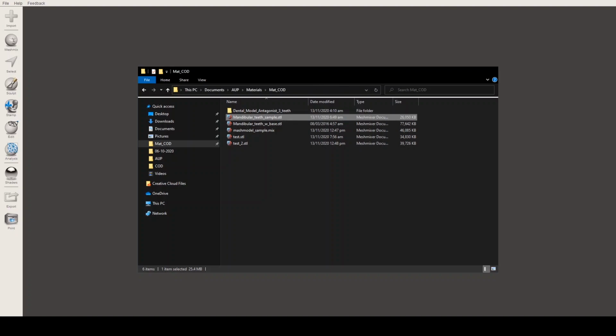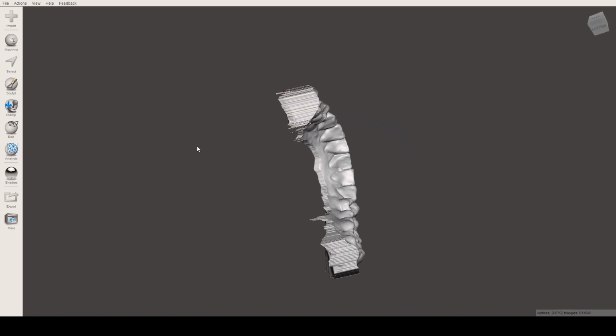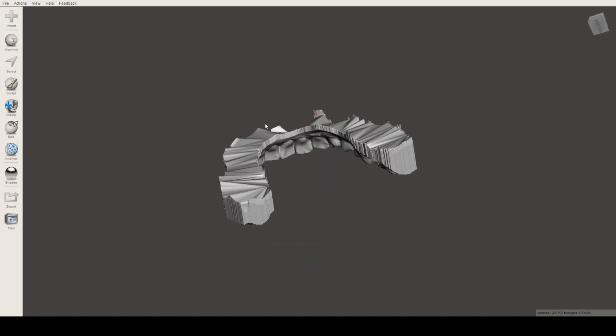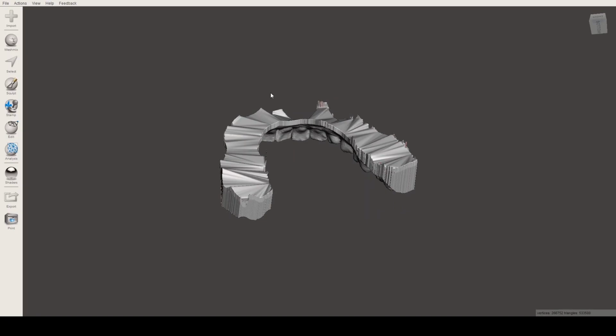So how you can open it is you can drag this into Autodesk Meshmixer. So if you drag it, let's wait for it to open. By the way, Autodesk Meshmixer is kind of slow. It's not really slow, but it's slow if your computer doesn't have enough power to feed it. So my computer right now is quite slow, but I'm pretty sure when you work as dentists in the future, you will have powerful computers, or you will have software that is optimized for usage, or that will not consume an amount of resources that will make your computer slow. So hopefully they update this, or they make better versions of 3D manipulating software.